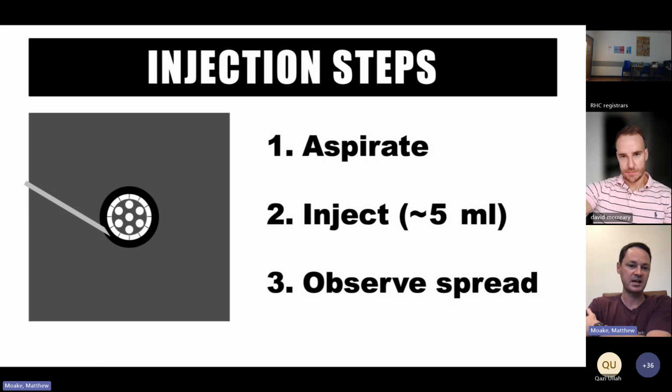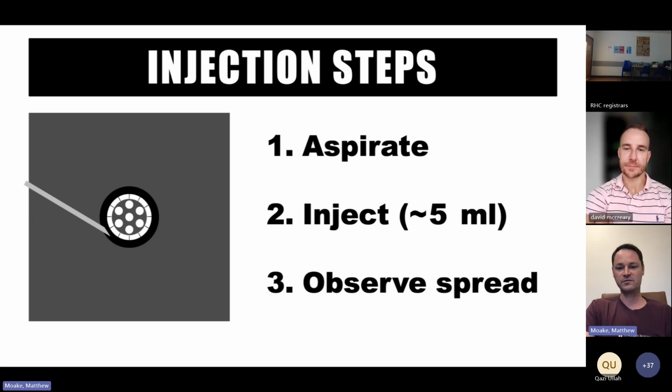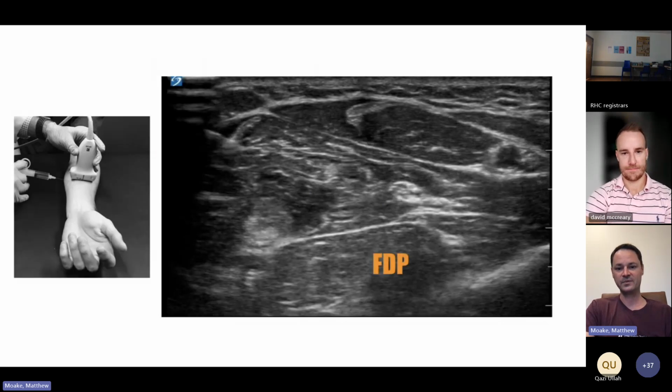Again, steps when you're doing that, you've already visualized the needle where it should be, and that's where you want it to be, and most importantly, that it's not in a vessel. You should still aspirate with ultrasound guidance. The importance for that is honestly probably less than it is when you don't have the visualization with ultrasound. And then inject your anesthetic in slow increments. It should be around the nerve, not in the nerve, and observing spread around the target.